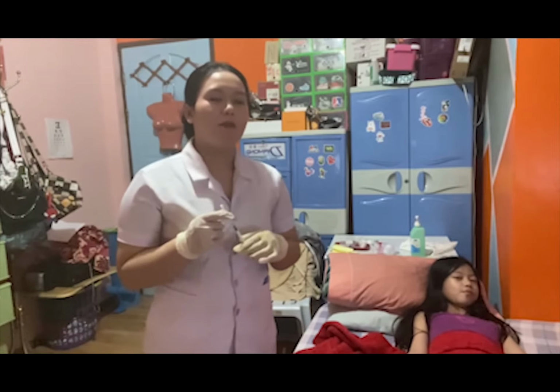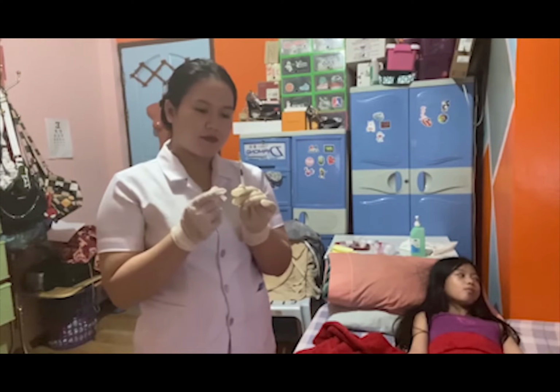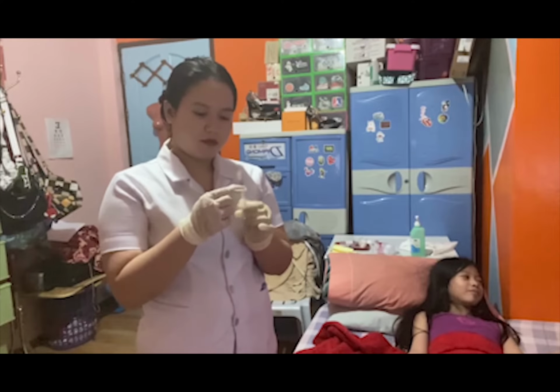Remove the cap and hold the syringe between the thumb and forefinger of your dominant hand with the bevel of the needle pointing up. Then stretch the skin of the patient with the thumb and forefinger of your non-dominant hand.